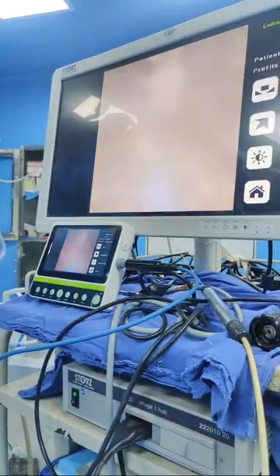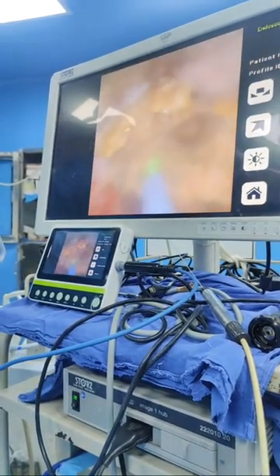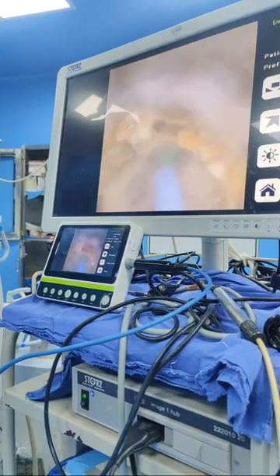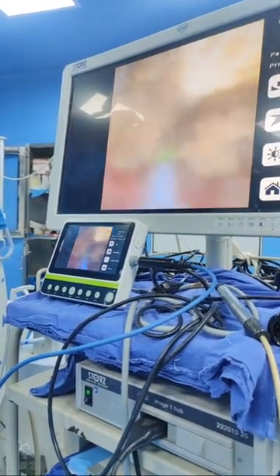So in a dilated system, yes, because it will collapse, it will suck. That is a very big collapse, not this. But because of the suction, it is not going into the system. And of course the size is also there.